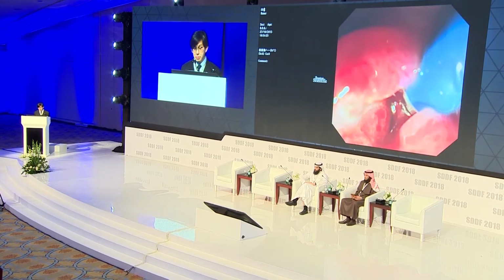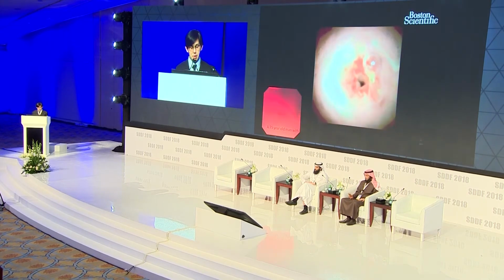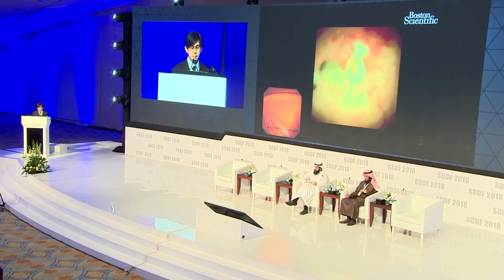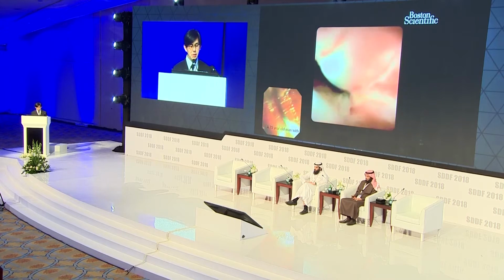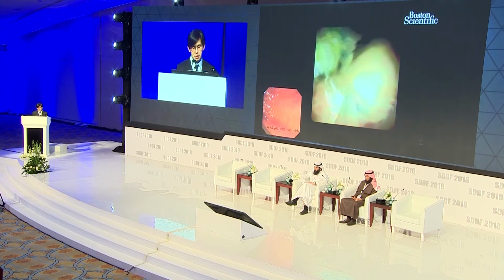Please play the video. This is a case of mid-bile duct stricture, and it belonged to a 75-year-old man. You can see, for some of the so-called indeterminate strictures, the Spy appearances in fact produce very characteristic features of neoplastic stricture.